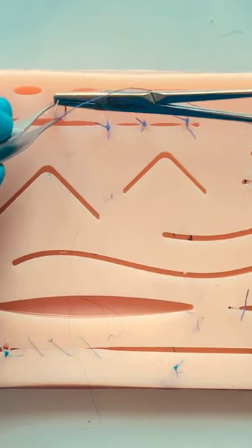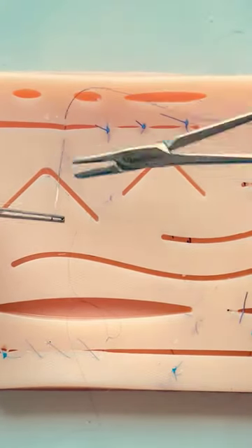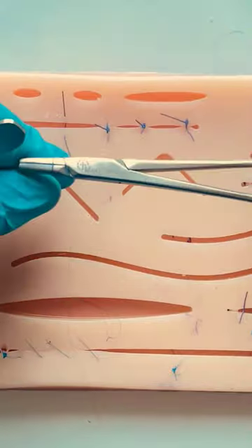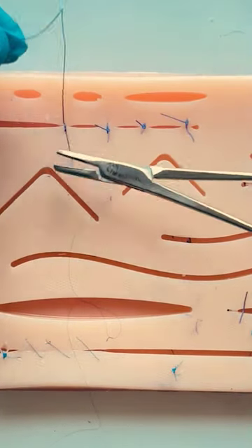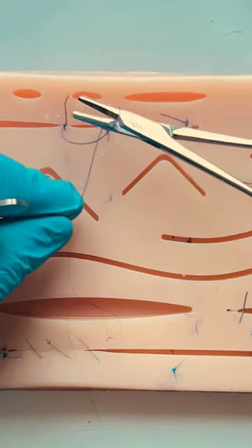When you tie a knot, keep the short end around 2cm long and hold the long end reasonably close to the wound bed. Wrap the suture around the tips of the needle holder and retrieve the short suture by its tip. This prevents getting caught in knots.